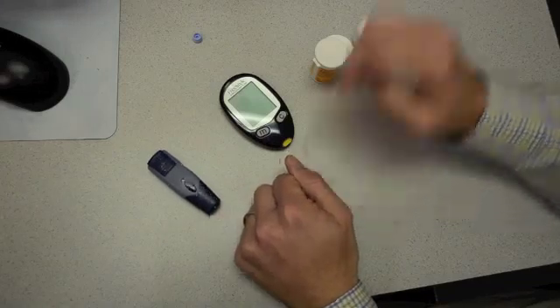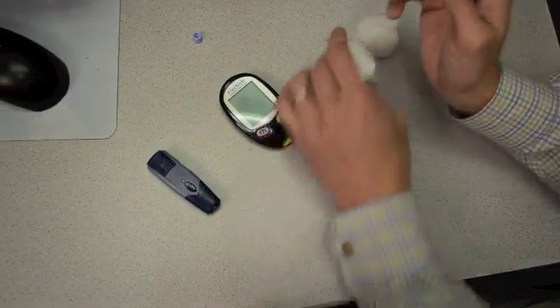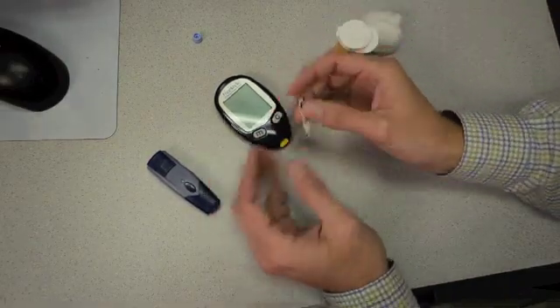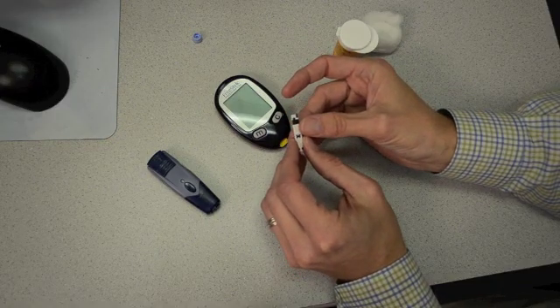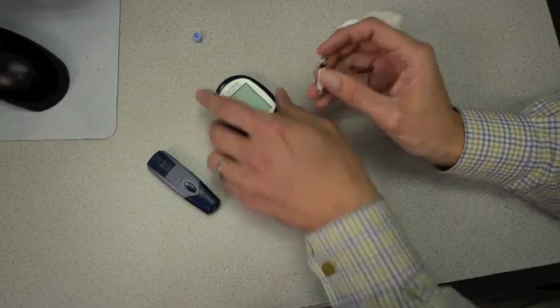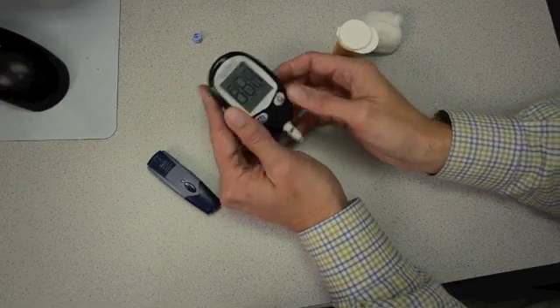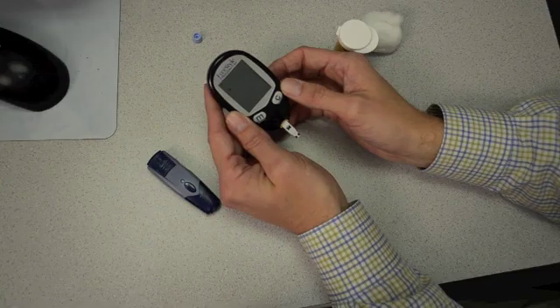After loading everything up, we basically just need to take out a test strip so we can get the blood into the meter. Every meter has an individual specific test strip that goes with it. Check with your doctor or pharmacist to make sure you're getting the right strips and the right meter for you. With this particular one, I'm going to slide it into the end — it turns the meter on and then tells me it's ready for a drop of blood.